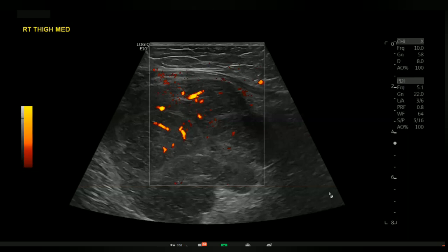Good. Why is that important? To discriminate a lesion, whether it is fatty or to categorize the lesion. Well, the number one reason it's very important is because if I was to scan 100 patients with lumps and bumps, I'm pretty sure 90% or even more than 90% of them will turn out to be fatty lumps. So the purpose of ultrasound is basically to differentiate.